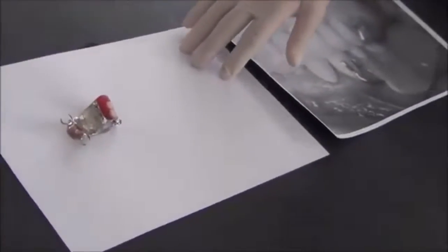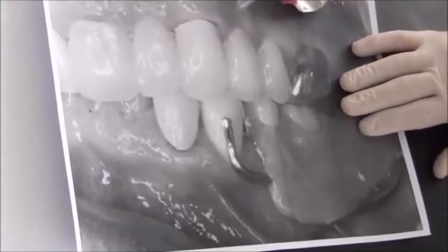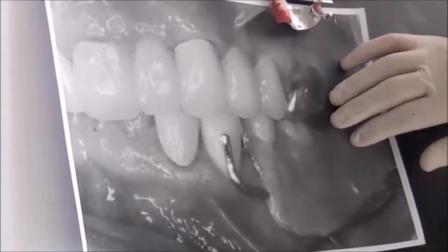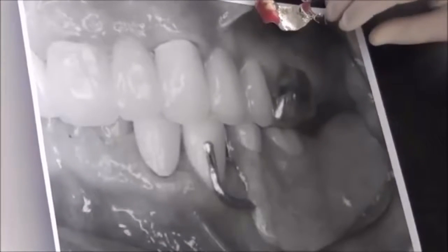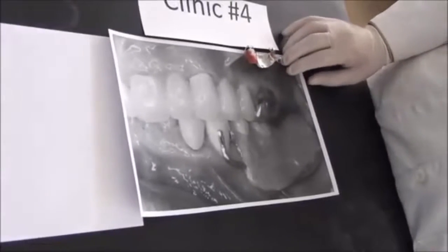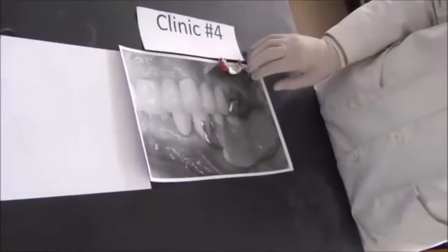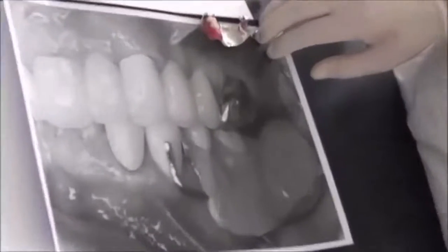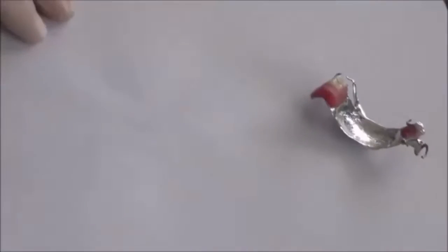And the doctor has the partial denture there. He places it inside the patient's mouth. He tries it in. He makes sure the wax shape is suitable for the patient. He makes sure that all of the components of the RPD are engaging in their place. Make sure the occlusion is correct. The boundaries of your RPD are all correct. And sends them back with an authorization to complete the acrylic.